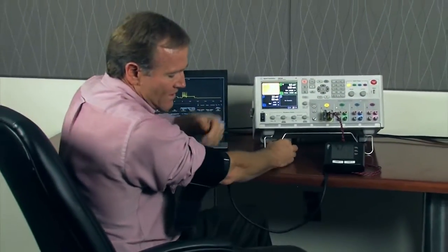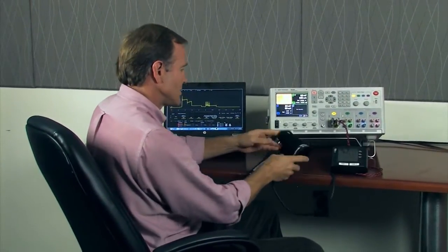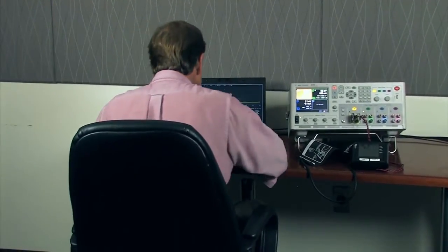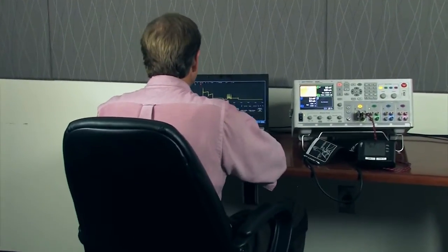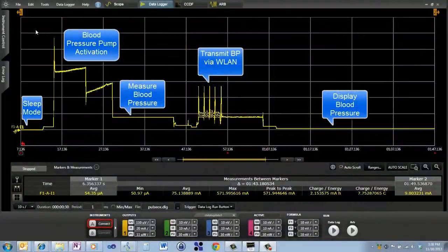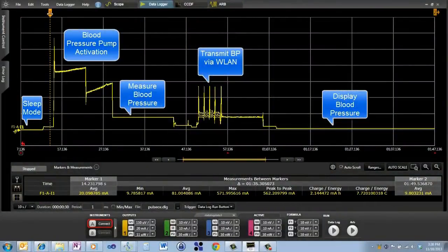So now that we have the data log, let's take a look at the current trace. You'll notice that I have a couple of markers that I can set up. And so I'm going to go ahead and move those markers.